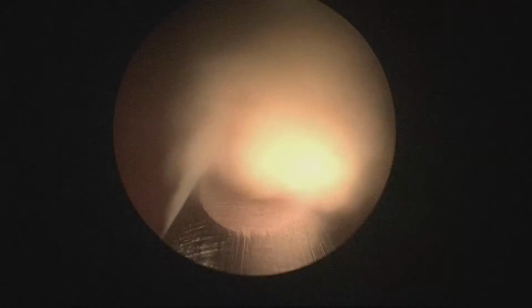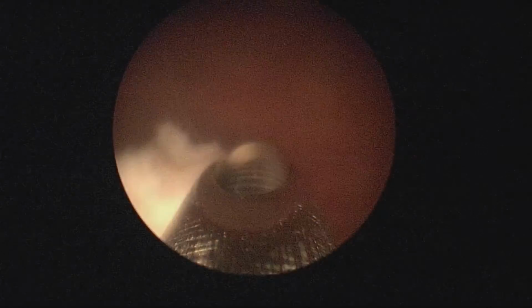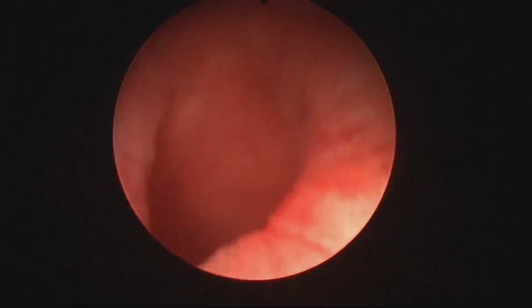So this is the end of the adenomatous tissue, now coming out. Typically the morcellator chooses the easy parts first, and the fibrous parts are more resistant, so they're left for the end. And this is when we have these beach balls that are a little bit more difficult to morcellate. But in this case, it was perfectly possible.